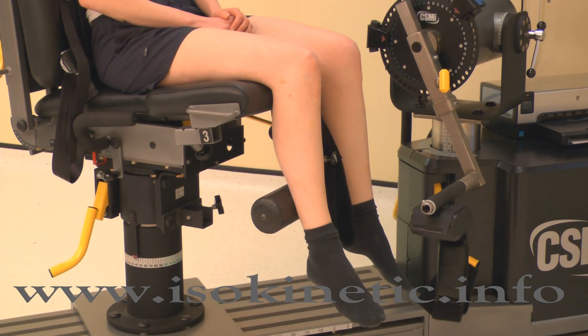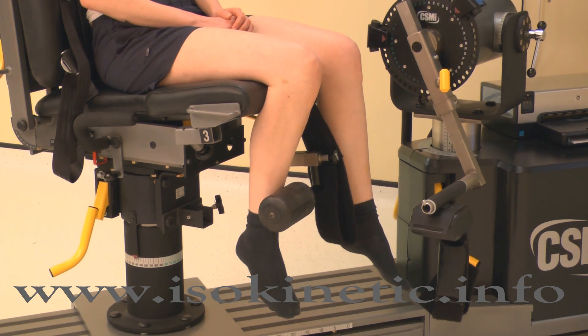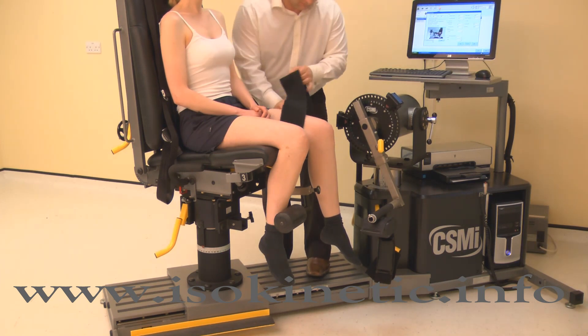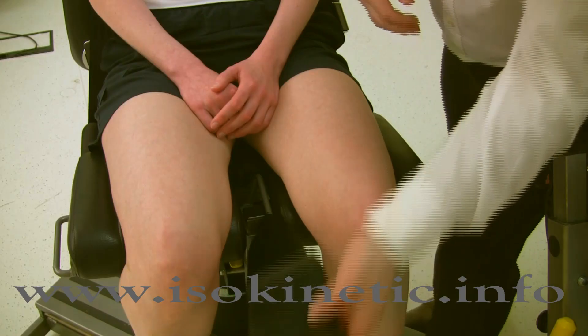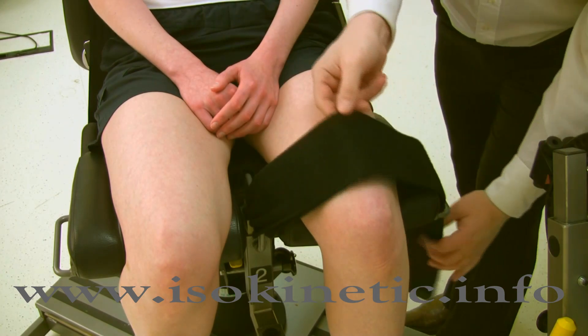To use the contralateral limb stabilizer, simply place the limb not being tested behind the pad. Now attach the thigh strap to the leg to be tested. Top tip: subjects prefer the strap tight; however, an overly tight strap can affect the results. Pull the strap to tension, but do not lever it into place.